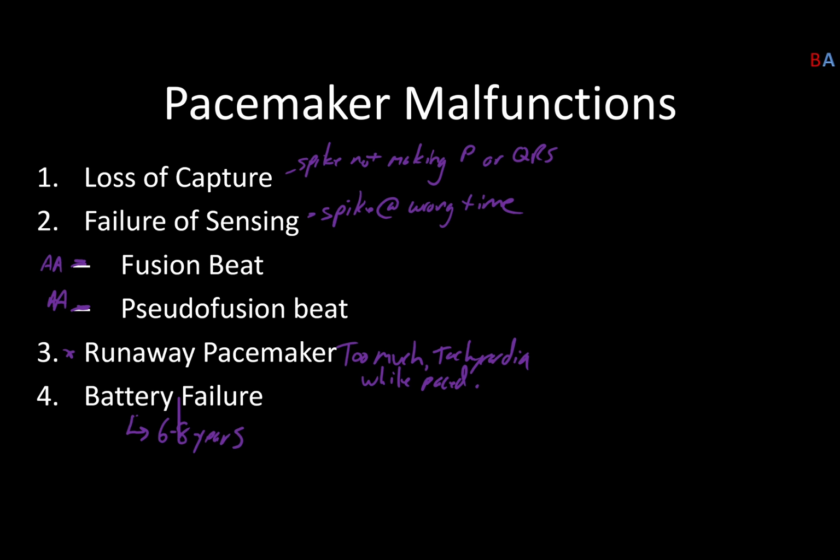And with that, when a pacemaker is getting close, it actually has a thing built in that gives you a 3-month warning. When it's starting to get low, it actually, during those communication periods, lets them know that the battery is beginning to get low.